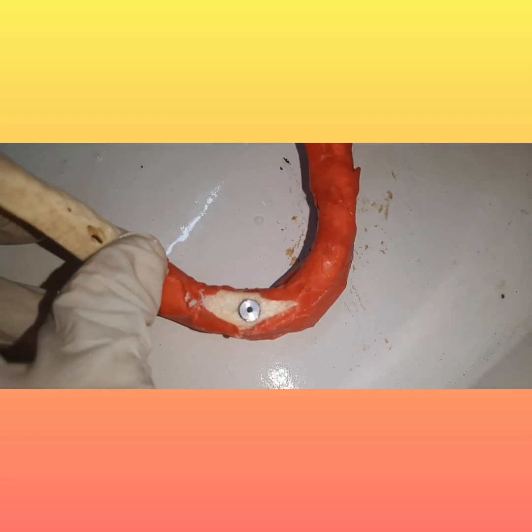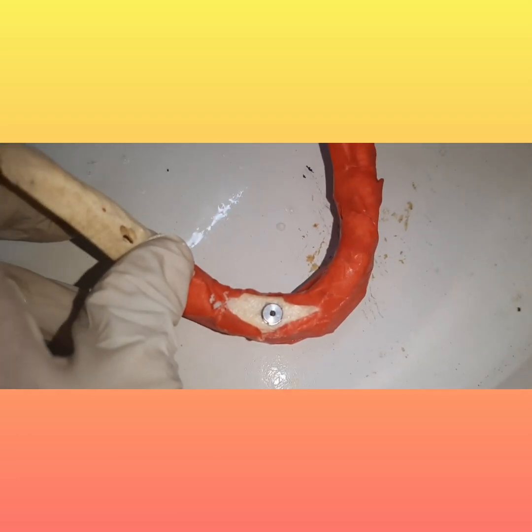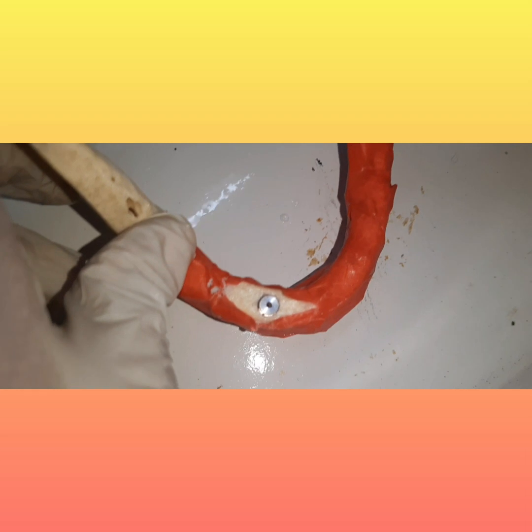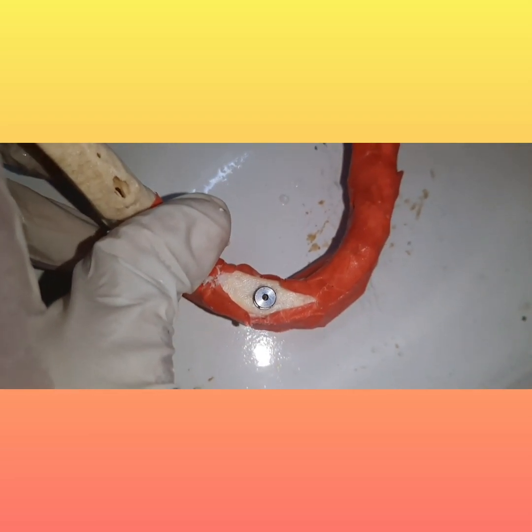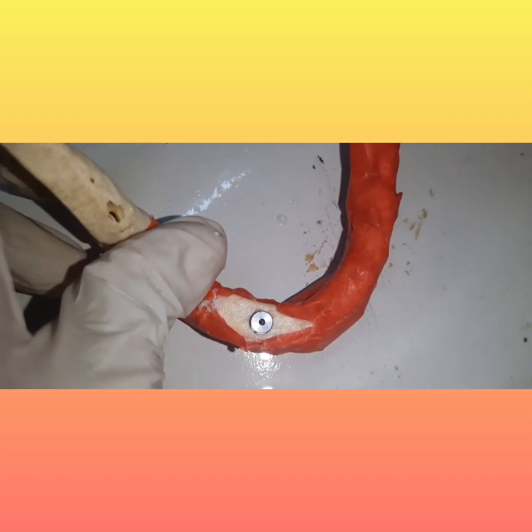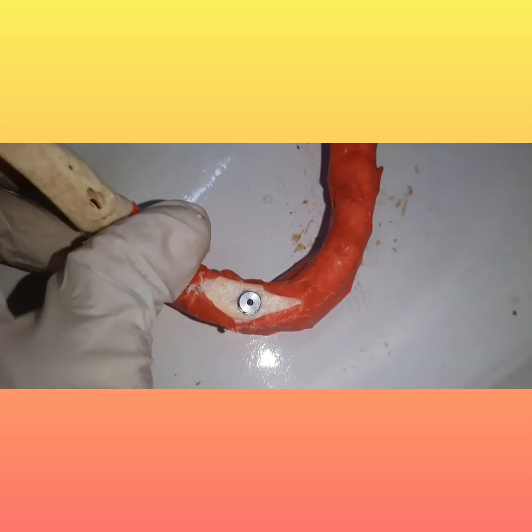So what are the keys for implant surgery success? One is minimize the risk of the infection, that is by careful preparation and using a sterile technique and using pre-sterilized packed components like the implants and the cover screw, and also giving an antibiotic coverage to the patient before the start of the procedure. Next, to minimize the tissue injury, you can do that by using a gentle surgical technique, using surgical stents so that you don't go wrong while placement of the implant, and that surgical stent can be based on your CBCT or your X-rays.